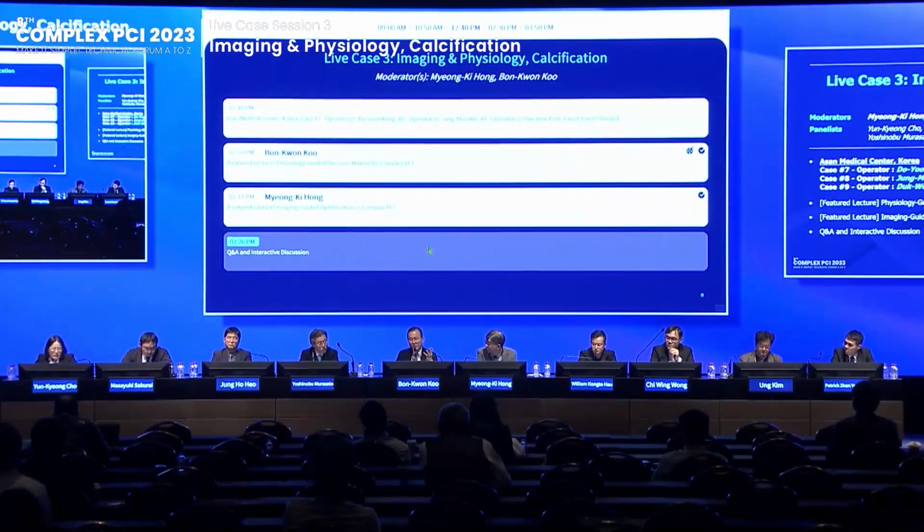So is there any preference according to the region characteristics or region types? So you mean in terms of resting, hyperemic, or angio versus angio-directed, or the invasive physiology? Yes.